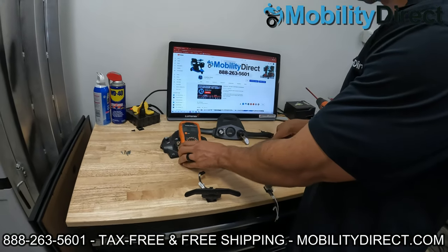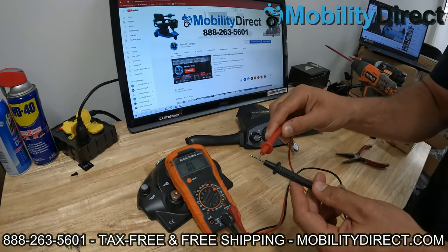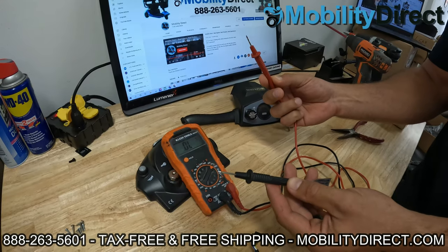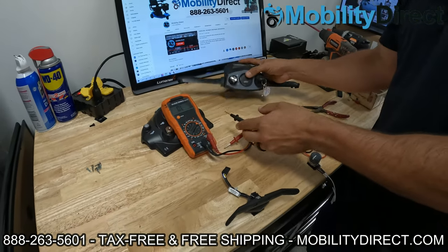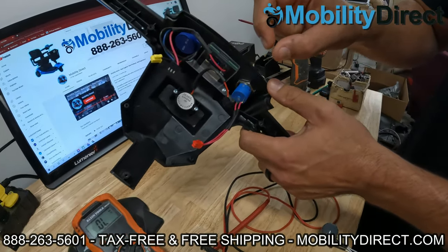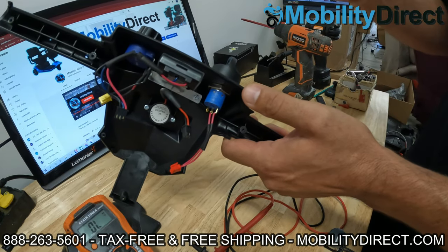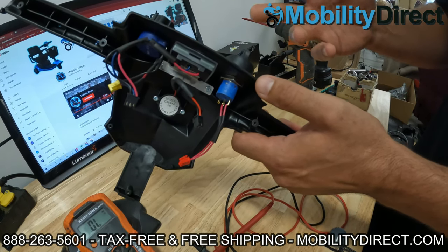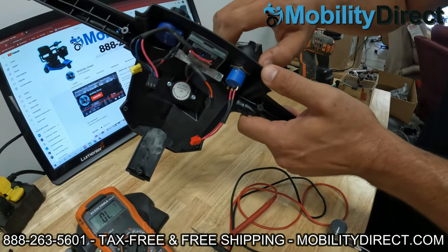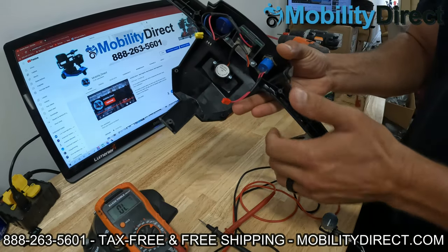Basically, it's going to check for a closed circuit. If I touch the two probes together, it should beep — that means the circuit is closed. When I take them apart, the circuit is not closed and it's not beeping. Now with an ignition, basically what's happening is when you turn the unit on, the two red wires form a closed circuit. When you turn the ignition off, it breaks the circuit. That's how the voltage carries through the ignition or stops at the ignition. With it off, there's no pass-through of voltage. With it on, the voltage is passing through from one side to the other and coming back into the controller, and that's what gives it the signal to turn on.